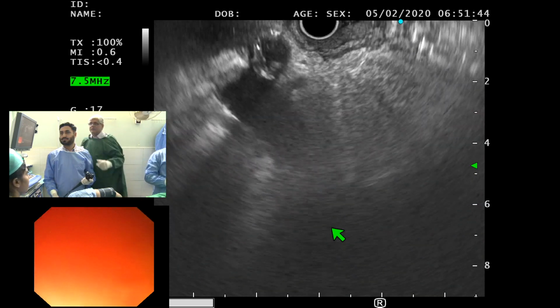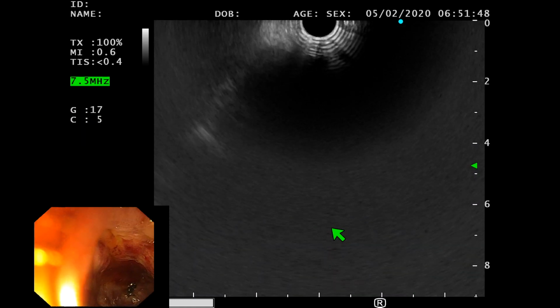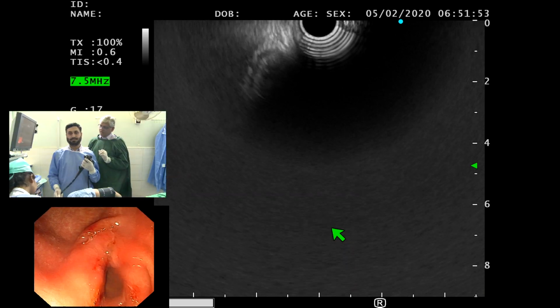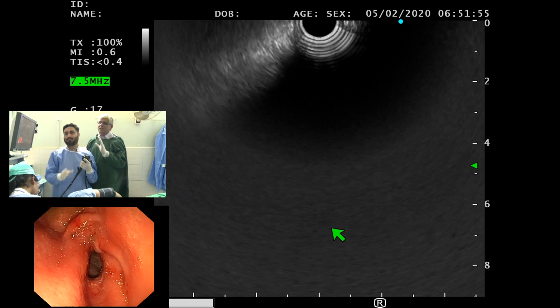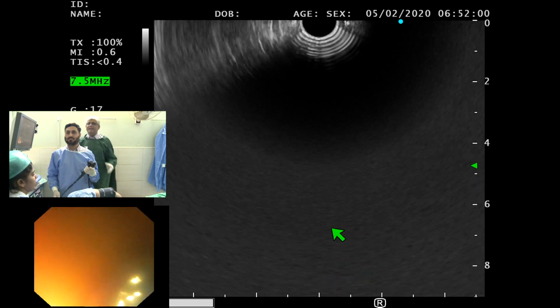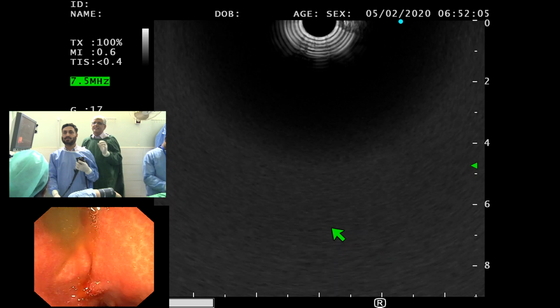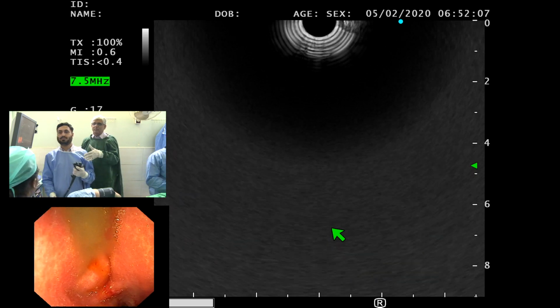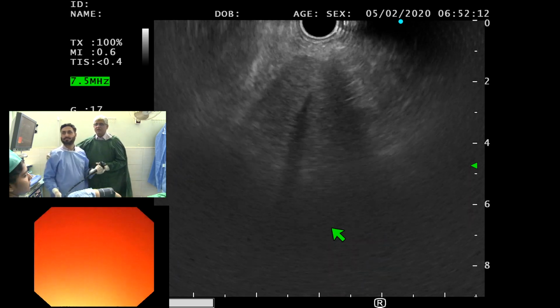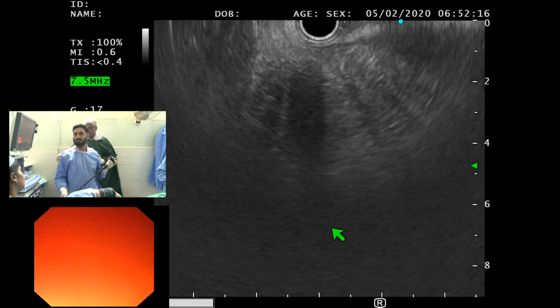While the patient is stable, now come back, let's go back to the stomach. So a lot of things will come with learning. Obviously, it will take time. The movements are very, very small, subtle. That is the key. The torque, straight scope, pull back now. Just come here. Right. That's it.